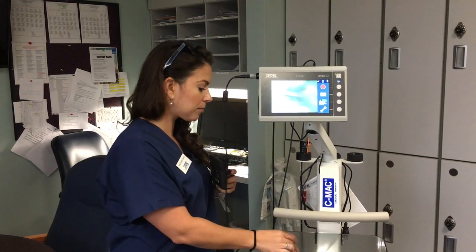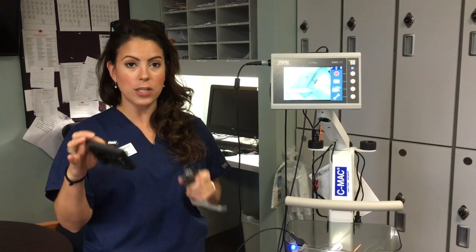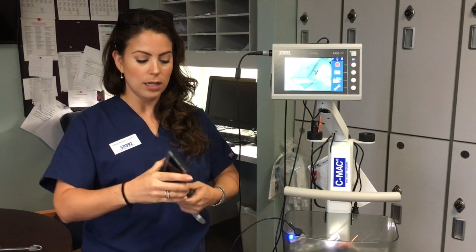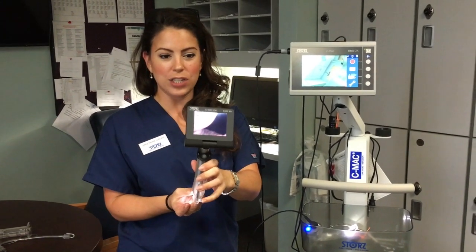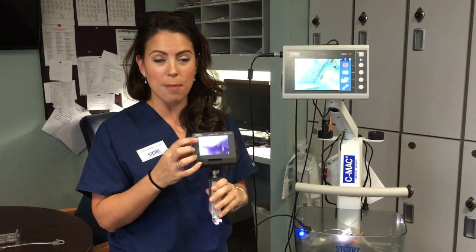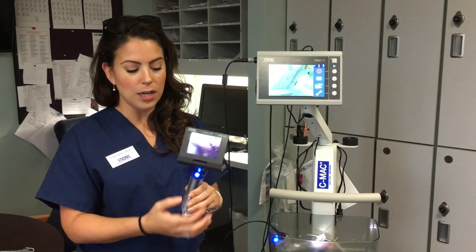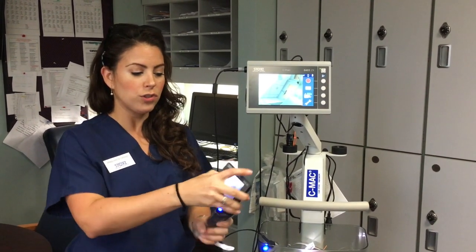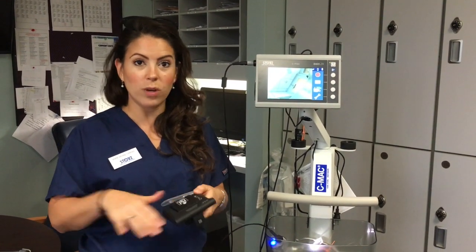This is your new pocket monitor. Just pull it off — no twisting, no turning, just pull it off. It attaches to both your pediatric and adult blades. Snap it on, and just open it to turn it on. You'll have great visualization, with battery bars at the top. You can take pictures and video using the blue button: press once for a picture, hold for a few seconds until it flashes green for video. Close it to shut it off. The battery is now attached directly, and while you're using one, a second is charging.